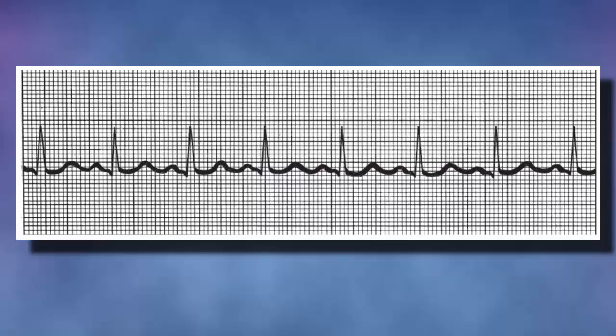You want to develop a programmed approach when looking at any type of diagnostic data. For the ECG strip, I'll suggest a simple approach which you can expand on later on when you learn how to identify pathologies, or you may want to experiment and design your own approach.